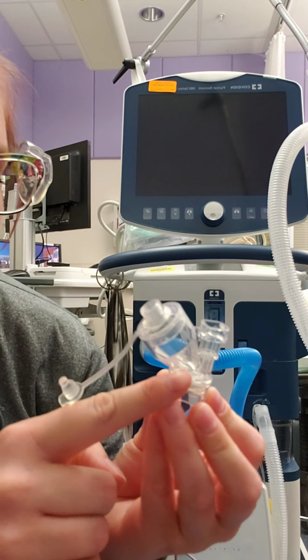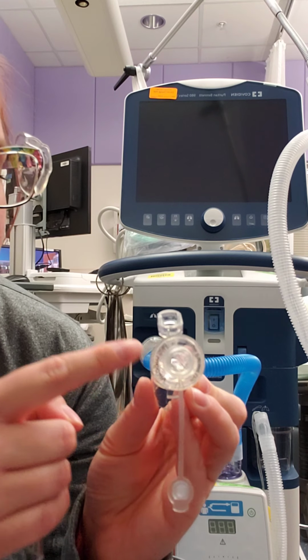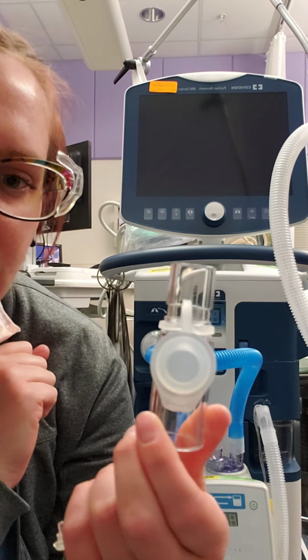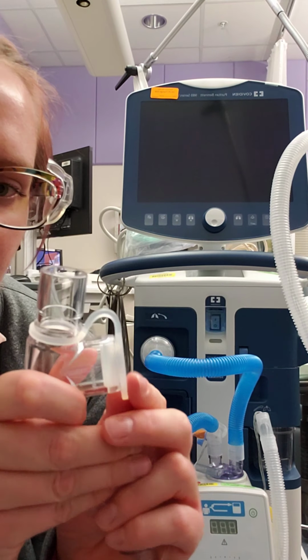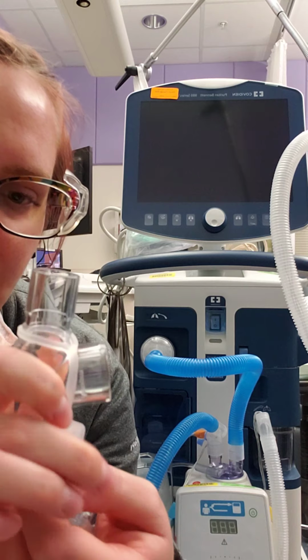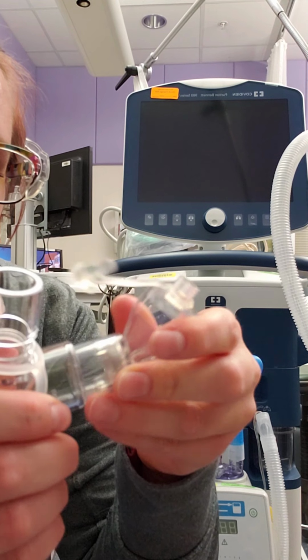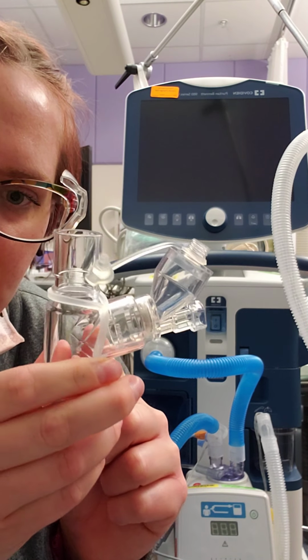There is a mesh nebulizer in there that will nebulize the medication. It comes with this T-piece, which you pop the cap open and you can fit the cup in here in the T-piece.